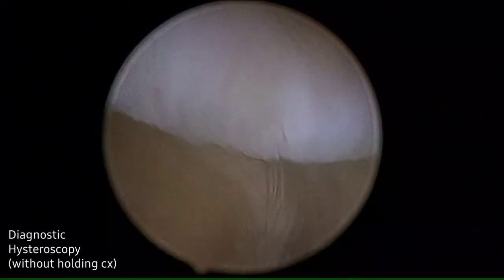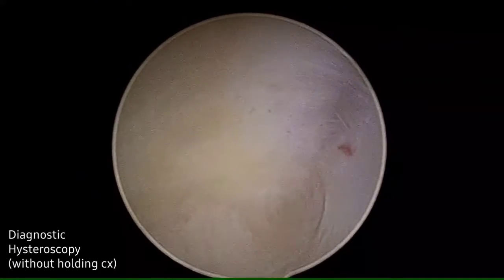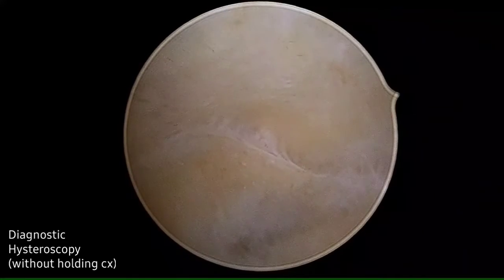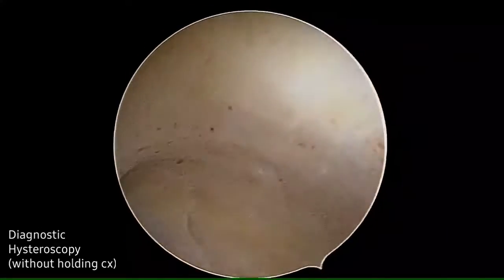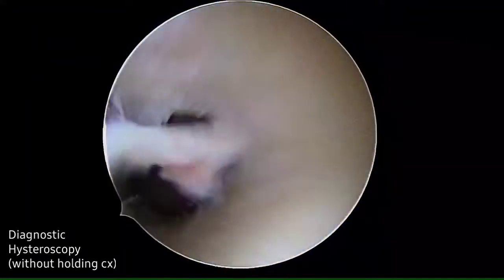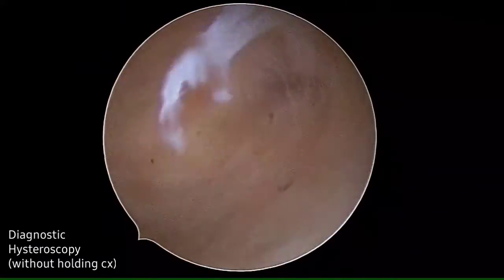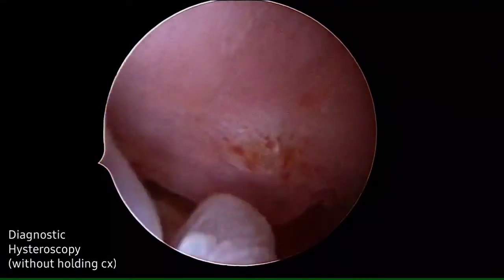So after doing hysteroscopy, we will examine the uterus and then we gradually withdraw the scope. While withdrawing the scope, we will examine the area where the negotiation was difficult to see whether we have created any false passage or not. Here a small bit of endometrial tissue was peeled off at the level of the internal os, otherwise the cavity is smooth and no false passage was created.